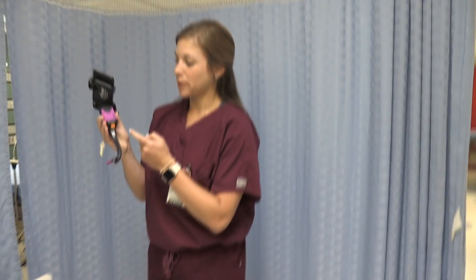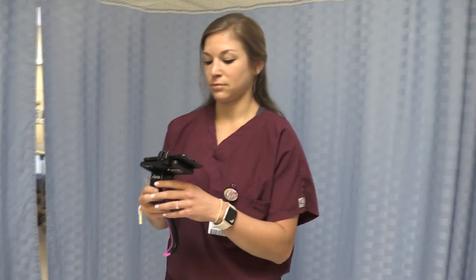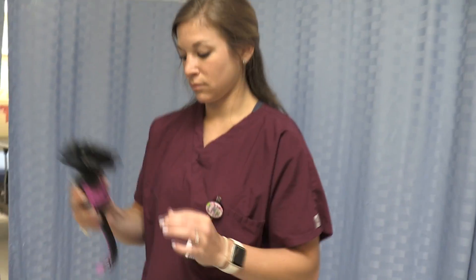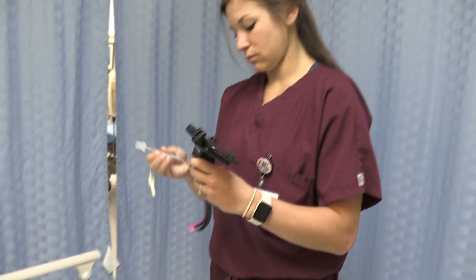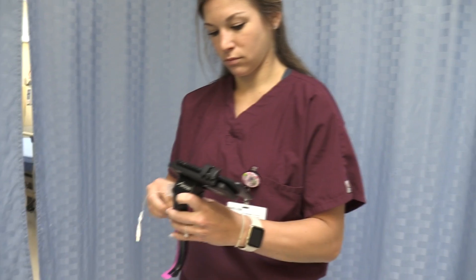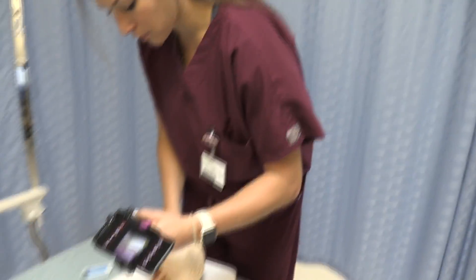First, press this button to turn on the light. It's going to blink for 30 seconds, using a heating element to prevent fogging on the blade. After those 30 seconds, the blinking stops. Now let's go ahead with the intubation.